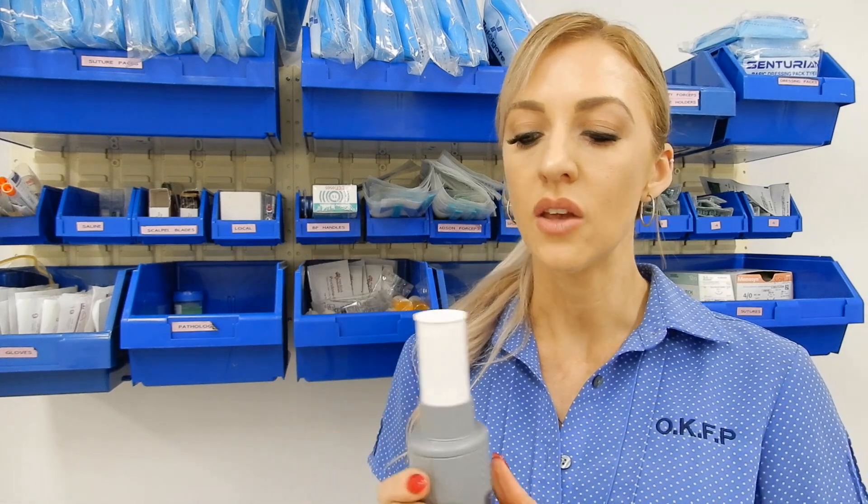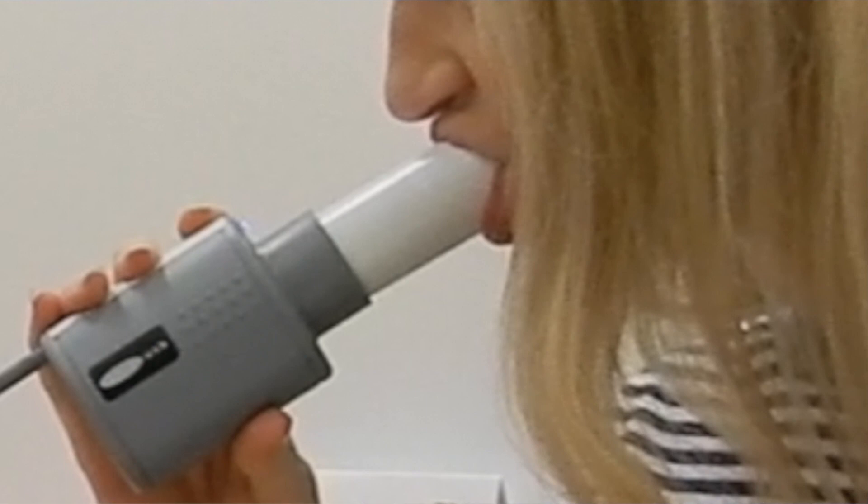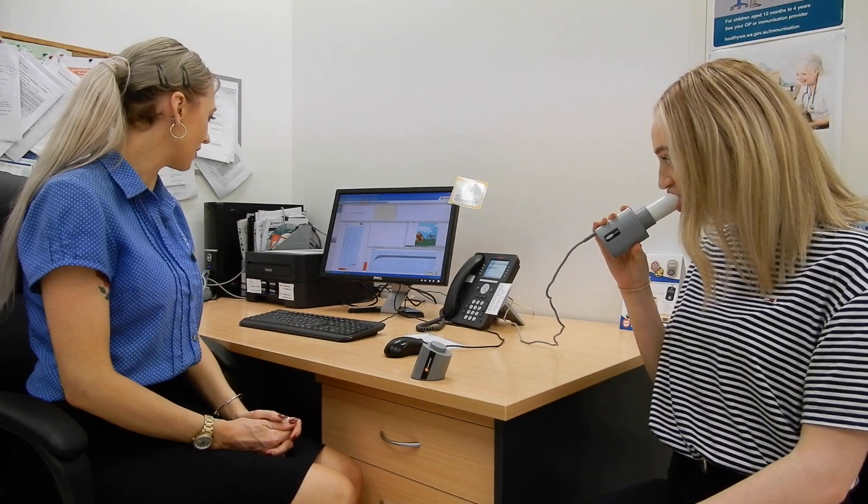The nurse will ask you to blow into this machine. When you do, it is important to remember several things. The first is that your lips must form a tight seal around the mouthpiece to ensure that no air escapes. When you blow into the machine, it is important to blow as hard and as fast as you can and to keep on blowing until the nurse says stop — usually for about six seconds.